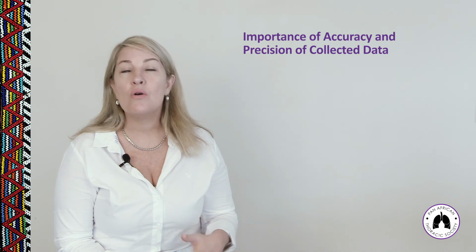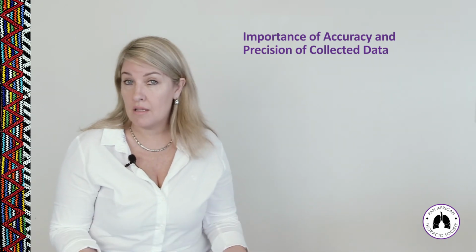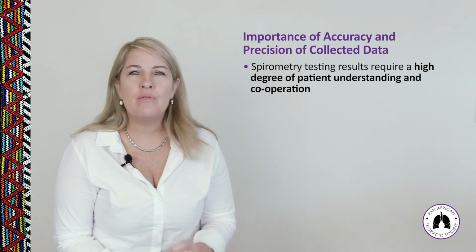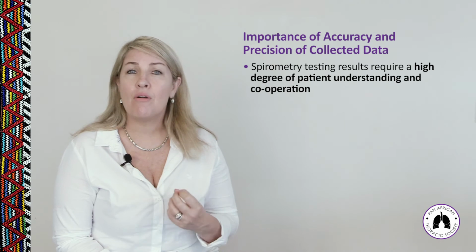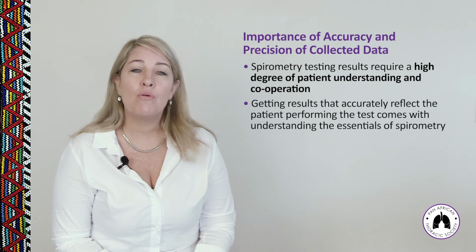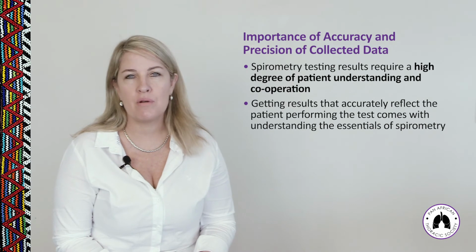So what we know is that whilst the results of other tests require no input from the patient, for example, an ECG or taking a blood test, the child really just has to sit there or lie there quietly to take those tests. With spirometry, it's different. We need a high degree of interaction and cooperation and understanding from a child to conduct a good spirometry test report. Getting results that accurately reflect the patient performing the test comes with understanding the essentials of spirometry.